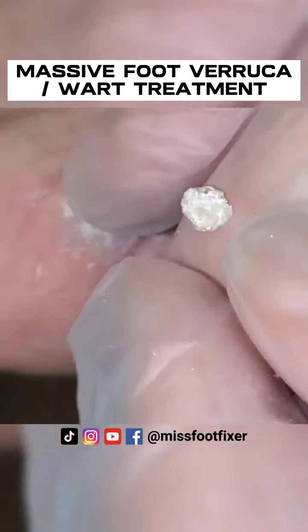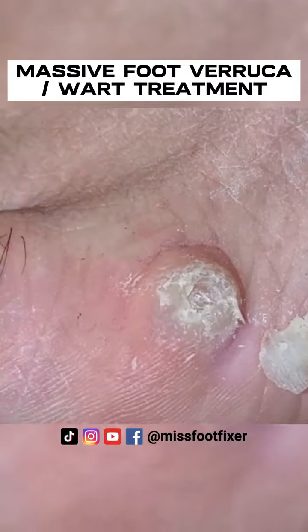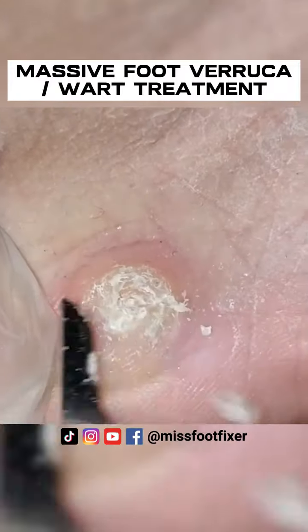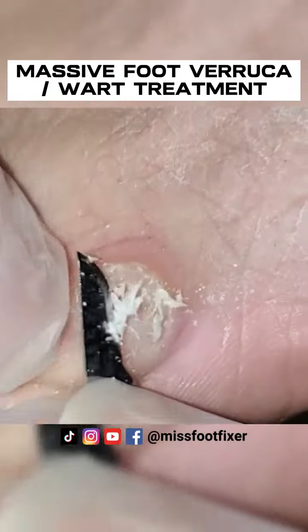It's really thick. Oh, look at that. Here you go, you can touch it. He's so happy. I'm just going to remove that. Definitely needs to change shoes, because it's adding lots of pressure.